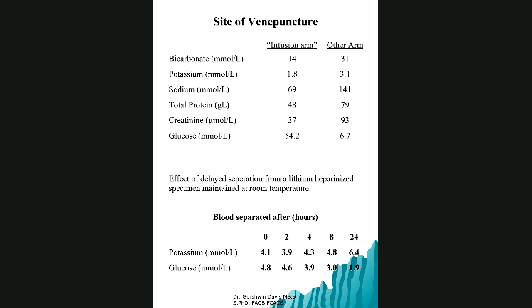once it has passed good clot formation, you need to separate, and you can then store that serum in the freezer, and then you can analyze. Once it's left on the desktop overnight or for any delayed period, you're likely to get falsely elevated potassium. And as I said, you don't treat the results, you treat the patient. Okay? So if you have a result that comes back with potassium like 10, 11, 12, immediately you know something is wrong because at that level of potassium, the patient will be dead. And you have the patient in front of you.